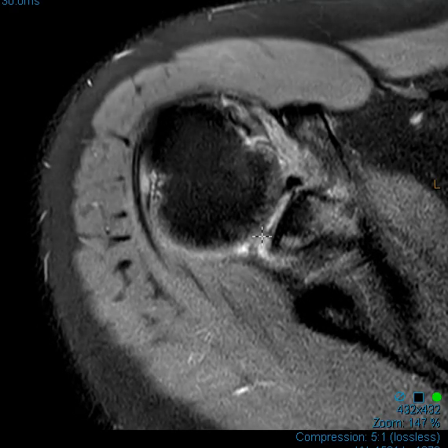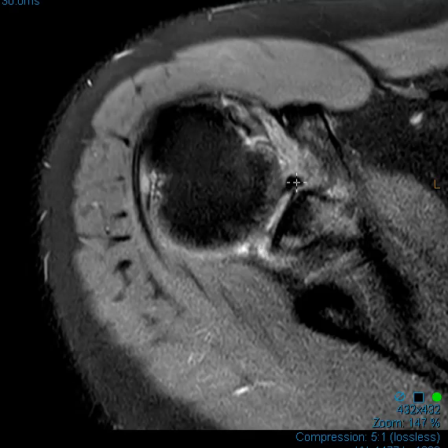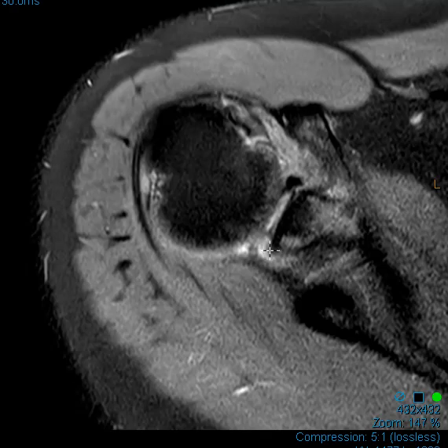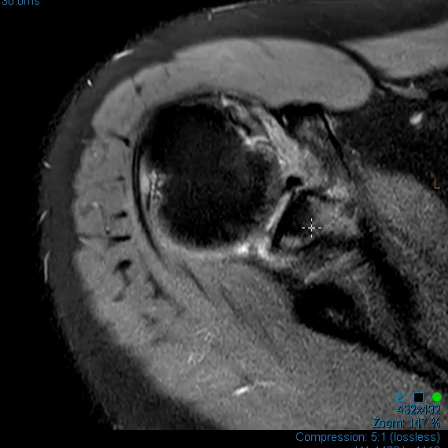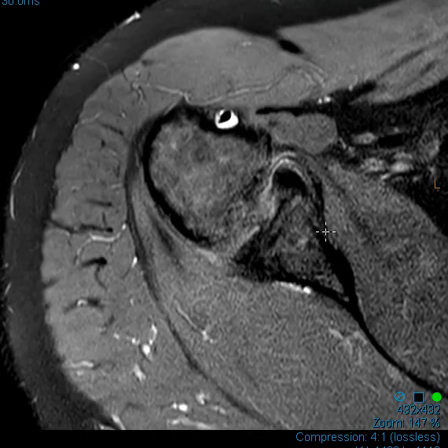On this view, we see white, or high signal here. So this is fluid signal, and there's a horizontal tear right through the base of that labrum. So instead of a nice triangle, we see a fluid-filled tear — a complex tear of the posterior superior labrum, and this is what is inciting the inflammatory response that we call adhesive capsulitis.